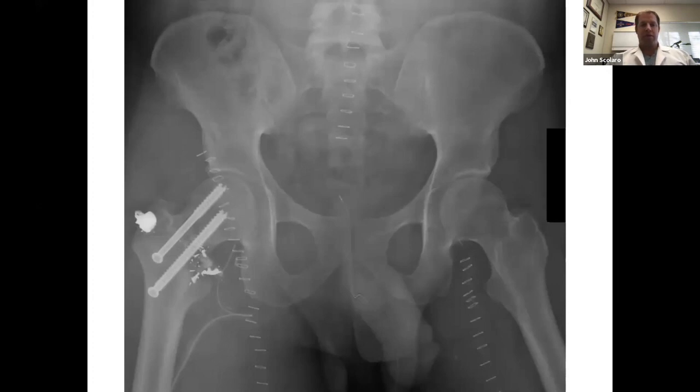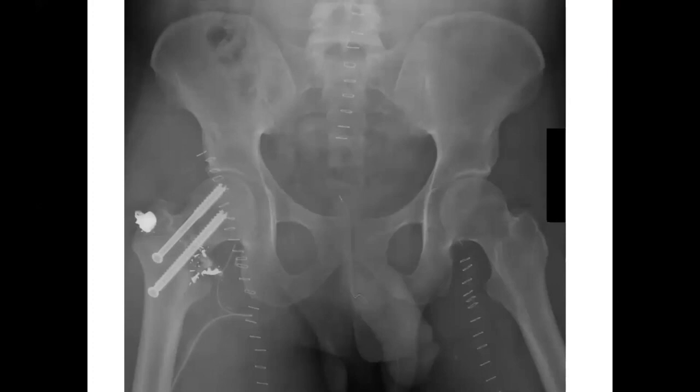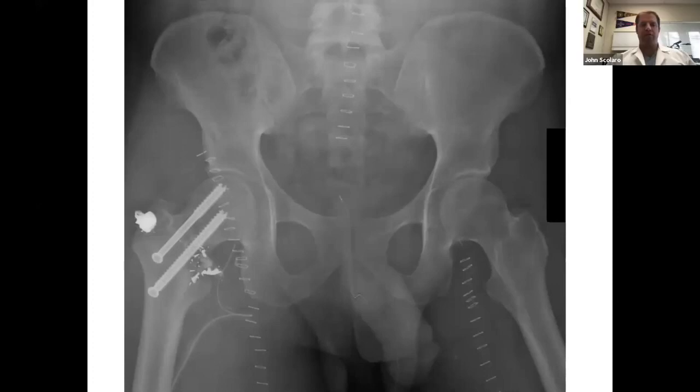And so again, this is about 3 days later. The patient was much more stable at that time point. The reduction and fixation appeared unchanged based on what we'd obtained previously, but looking at the CT scan and looking at our radiographs, we had an opportunity for another screw. I wanted to place this kind of off axis from the other screws which were placed. I really liked what I had, so I didn't want to change that. And so proceeded with placement of one more screw, a little bit.